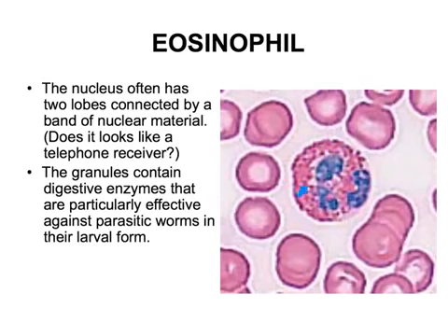These leukocytes right here are eosinophils. Now you will not be asked to identify an eosinophil on your lab practical. We will be going over basic white blood cell anatomy and how to differentiate between our basophils, our neutrophils, and our eosinophils. A student needs a little bit more knowledge than what they get in a typical anatomy class.